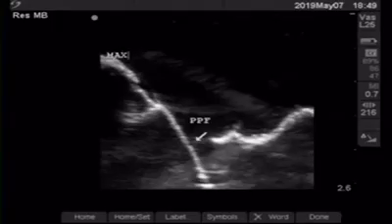From the zygoma, the probe is slowly shifted down inferior to the zygomatic arch and then tilted cranially. The structure you see on the left side is a steep hyperechoic area, that is the maxilla, and on the right side there is another hyperechoic area, that is the lateral pterygoid plate, and in between there is a valley or a fissure, that is the pterygopalatine fossa.